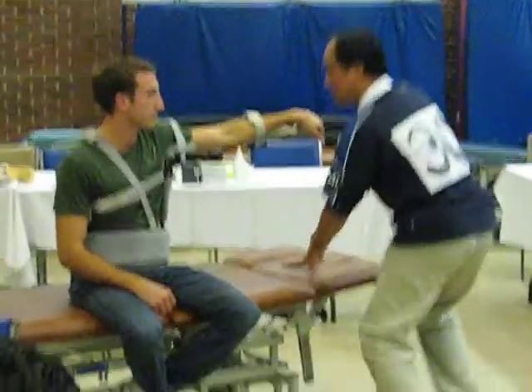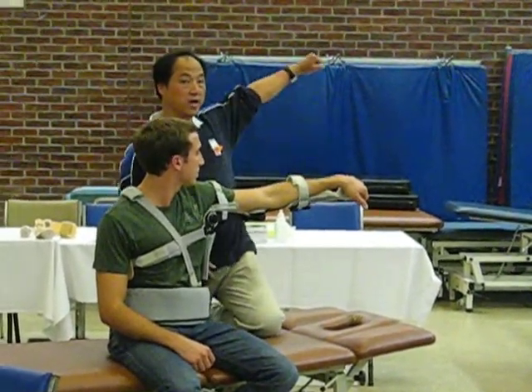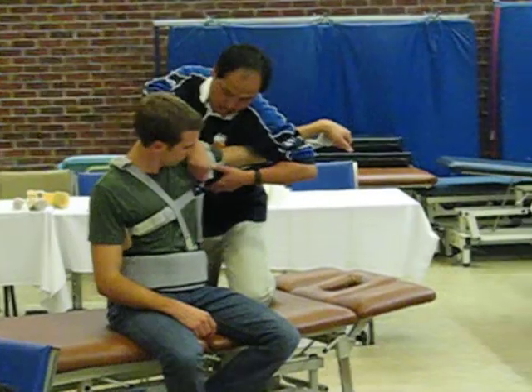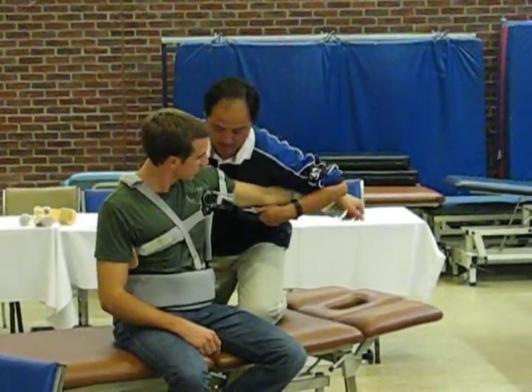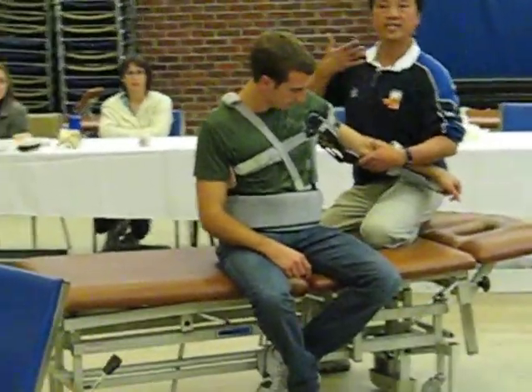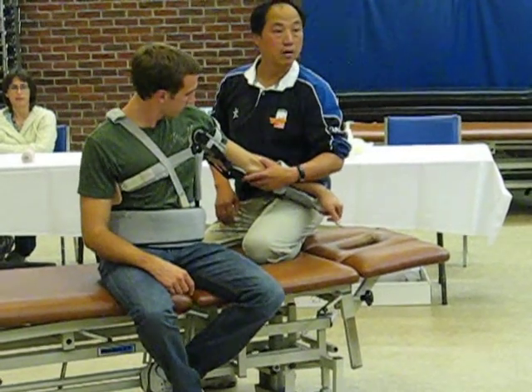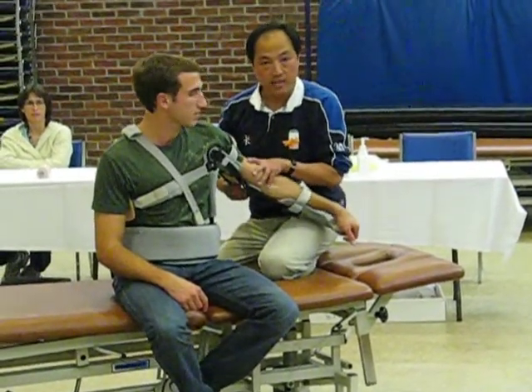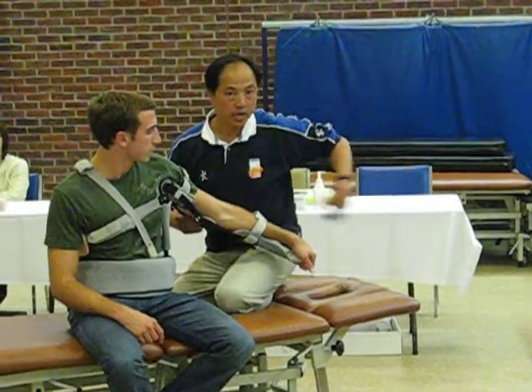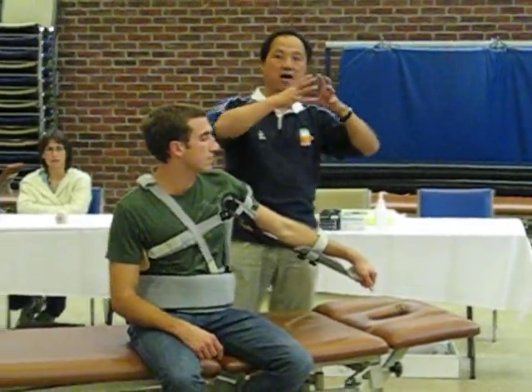The more important thing I want to show you is this: in case Matthew has a problem — say, if he can only come here and cannot go any further because of the tightness. Let's say it starts from here and our aim is to gradually raise it up. If he's here first, we lock it, and then it's not going to move anymore. Most of the time, if we aim to move it up, try to keep the elbow extended — because we want to have the full stretch. Otherwise, when you stretch and the elbow bends, they shake, and you may not get the maximum stretch.